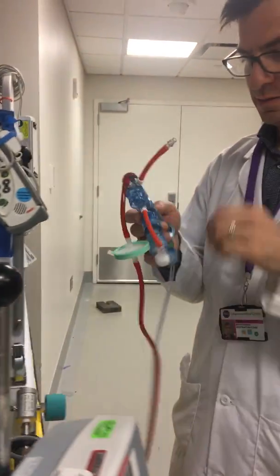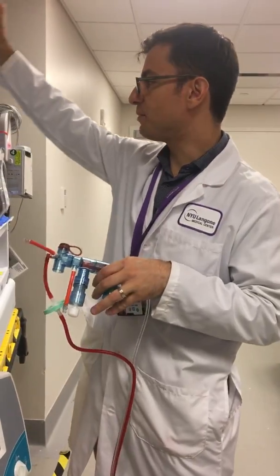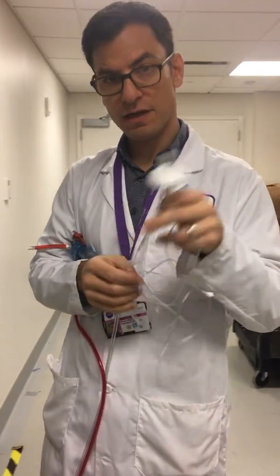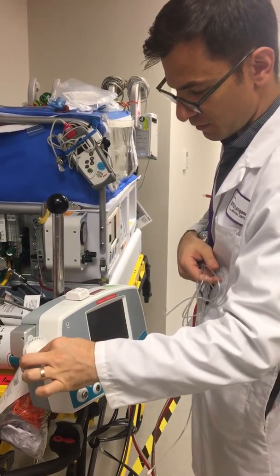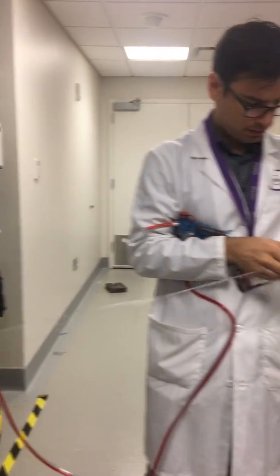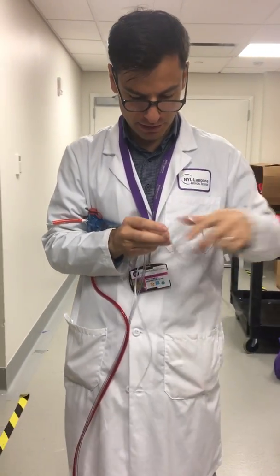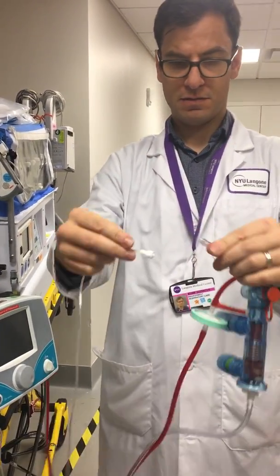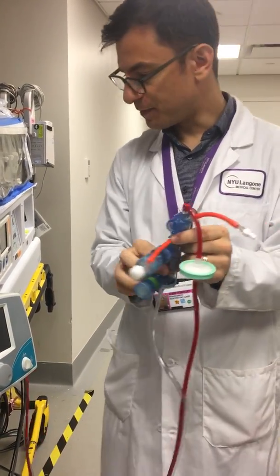First we're going to connect our nitric oxide sample line. This is Mallinckrodt's nitric oxide sample line and it goes into the DSIR plus head the way we're used to doing nitric oxide. So we're just sampling nitric oxide and we want to get a clear straight line, which is always hard to do. Now we're sampling the gas as close to the patient as possible.